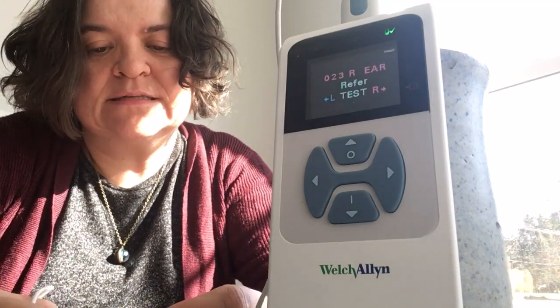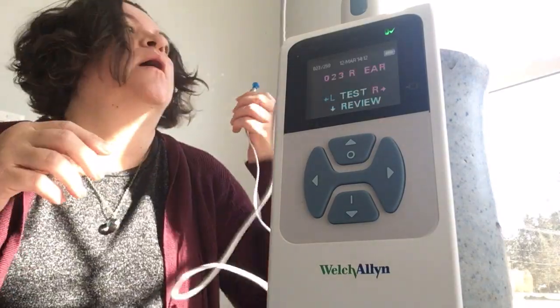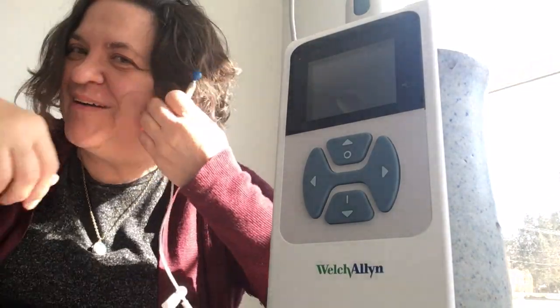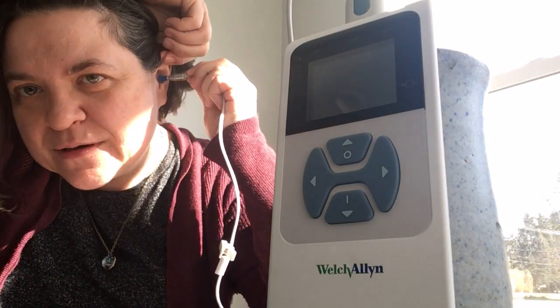I'm hoping that doesn't mean we're going to refer a bunch more kids to the audiologist. But we had some passes today on adults — well, one person. Let's try the other ear.